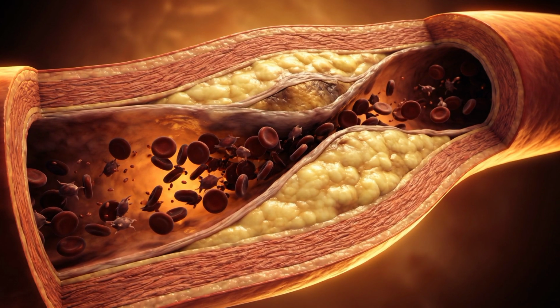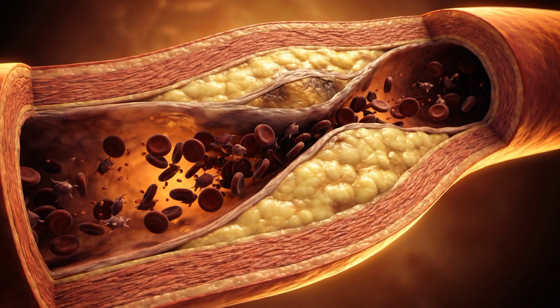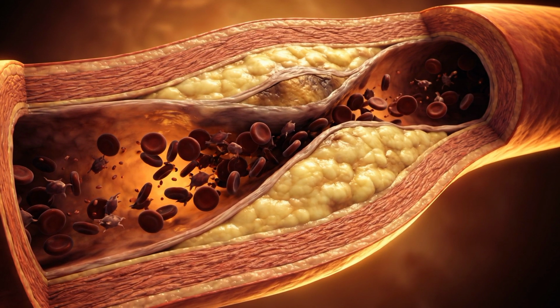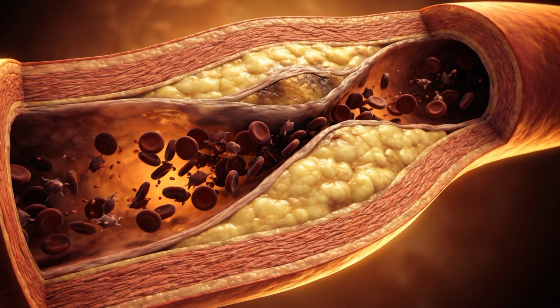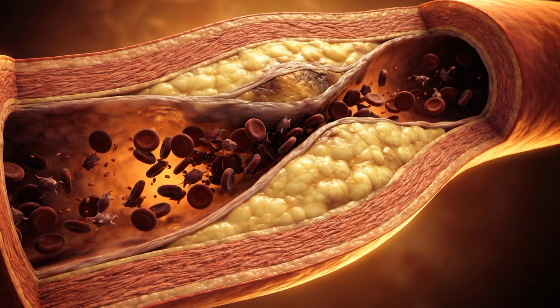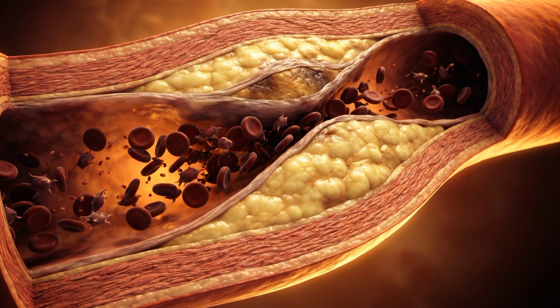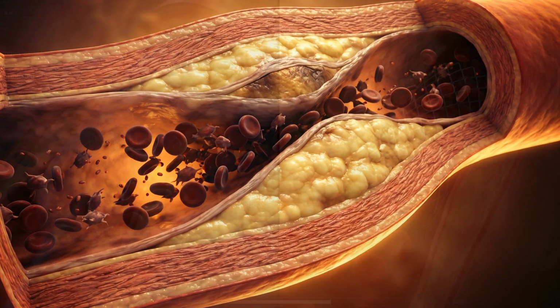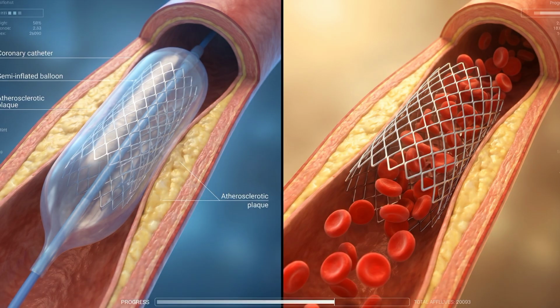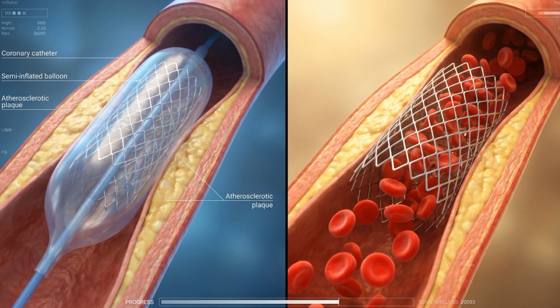So how will the blood vessels look if there is a blockage like this? At the side there will be fats accumulated, so the blood vessel is narrowed. What we have to do is inflate this blood vessel. That is the procedure we are doing here. The entire procedure is carefully monitored using advanced equipment. See, this is the balloon which I said, and this is the mesh.